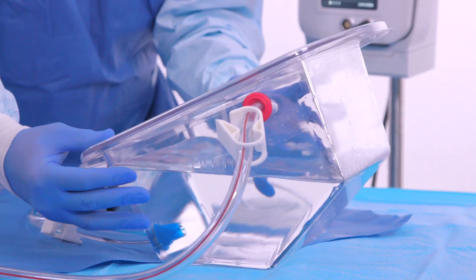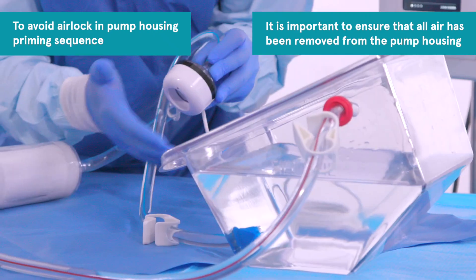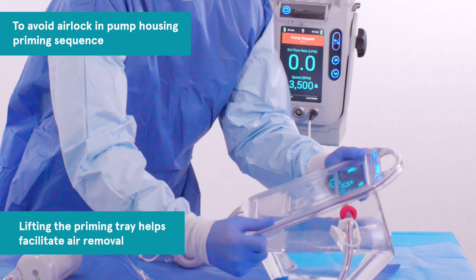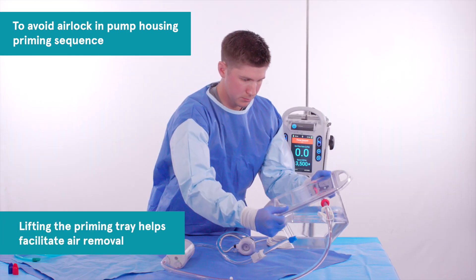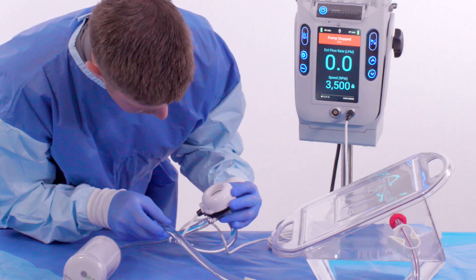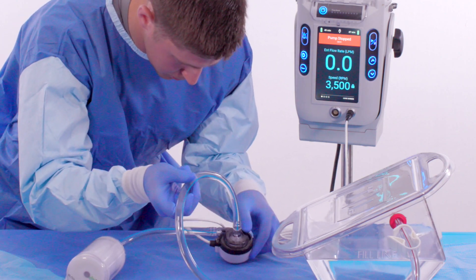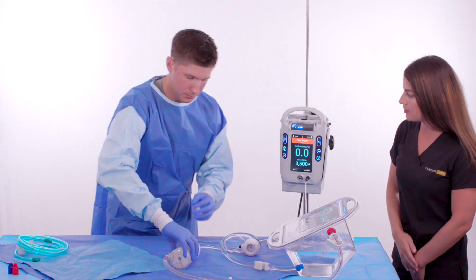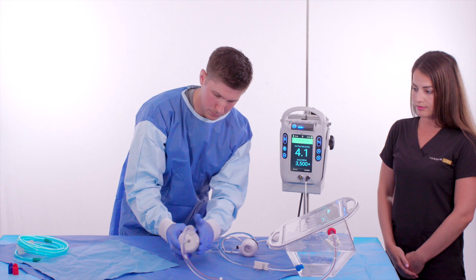It is important to ensure that all air has been removed from the pump housing. Lifting the priming tray helps to facilitate air removal. Manipulate the pump as necessary to ensure all air bubbles are removed. The non-sterile operator then starts the pump. The sterile operator orients the oxygenator so the outflow port is at the 12 o'clock position and gently taps the oxygenator to remove any air.